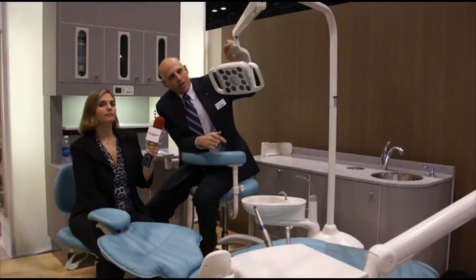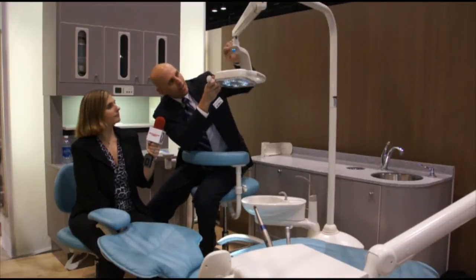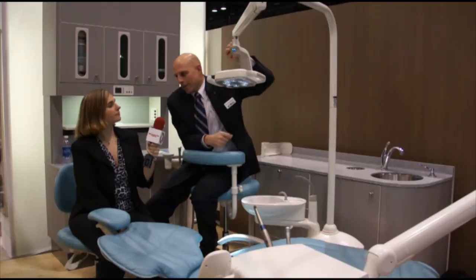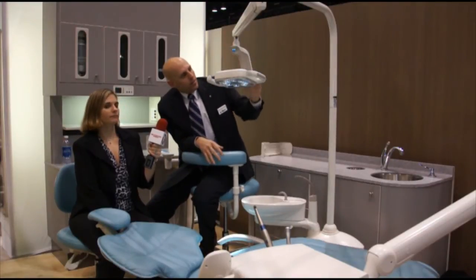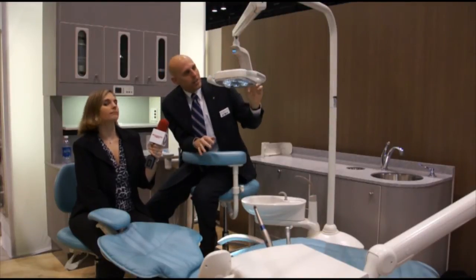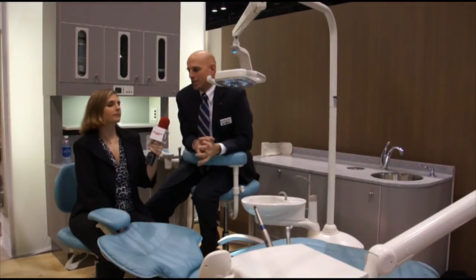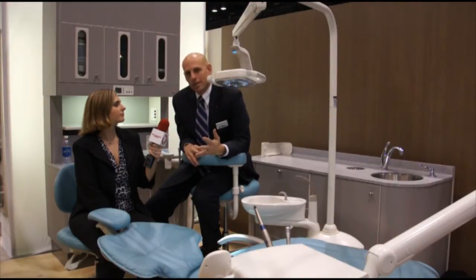And what those do is they offer four different modes of operation. When I turn on the light, you can see that I have a high setting, which is 30,000 lux, which is about 25% more than our existing halogen light. I also have a medium setting, 25,000 lux, which is equivalent to our existing light. And a low setting of 15,000 lux. These allow us to provide the dental team with the right amount of light based upon their personal preference and the procedure that they happen to be doing at the time.